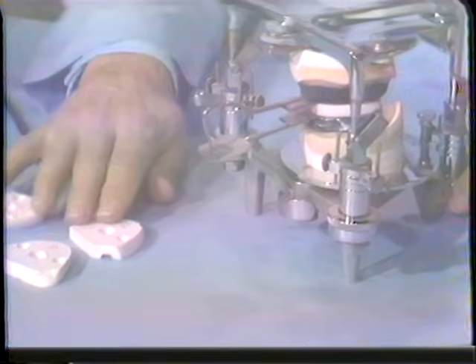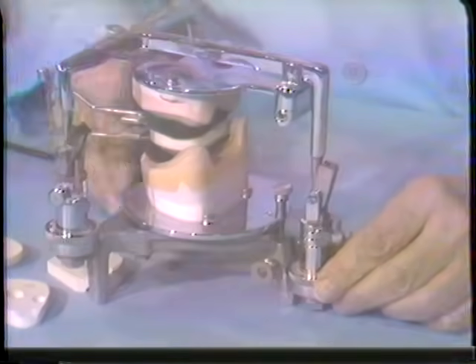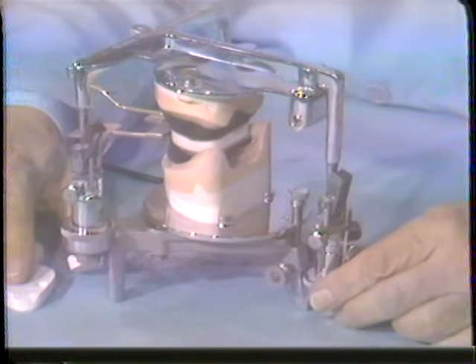These are left and right lateral positional records in addition to the protrusive record. The centric relation record, of course, within the instrument here to which the casts were mounted. So he designed what has been called the tripod instrument. There are actually three legs on the instrument. These turrets are turned to adjust to each position recorded.